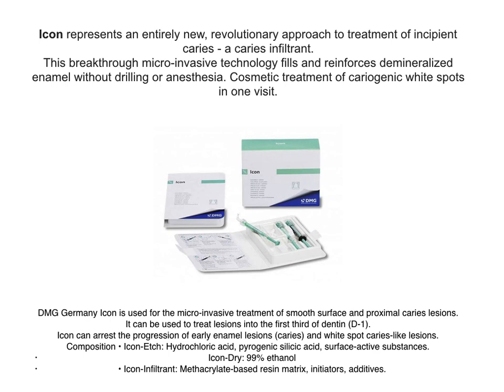The product that I'll be using to treat this white spot lesion in the subsequent video is Icon. It's a product by a company called DMG. It's a relatively new product for the management of such incipient lesions. It's very little in terms of invasiveness, as there are no drills, there's no anesthesia required. It's a cosmetic option for management of such white spots. It can be used in the initial caries lesions, even for proximal caries management.